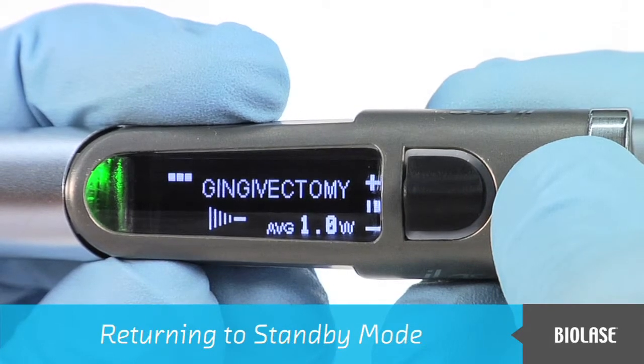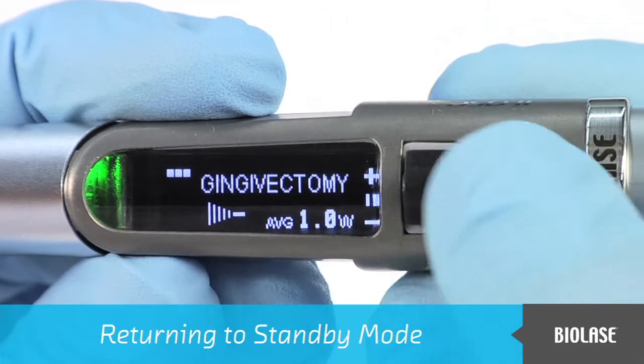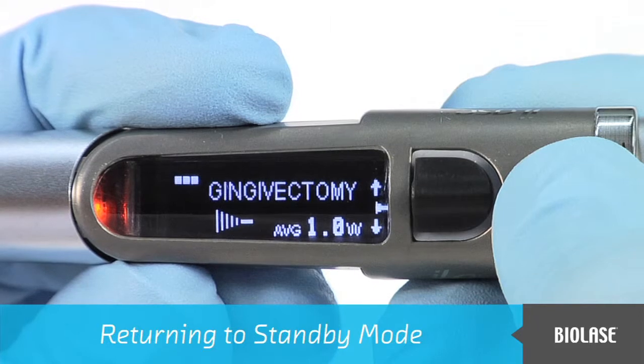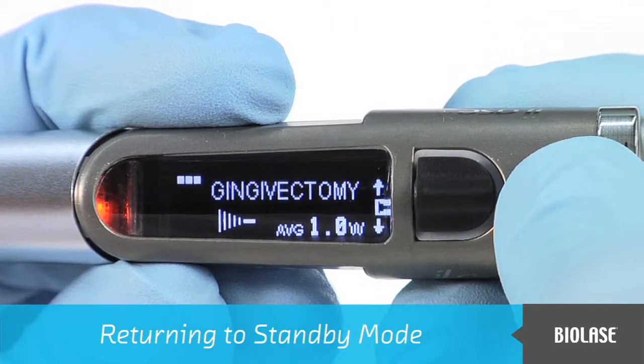To return to standby mode from ready mode, first make sure that you are not firing the laser, and then press in the black navigation button. When the LED becomes orange and the red aiming beam disappears, the iLase is in standby mode.